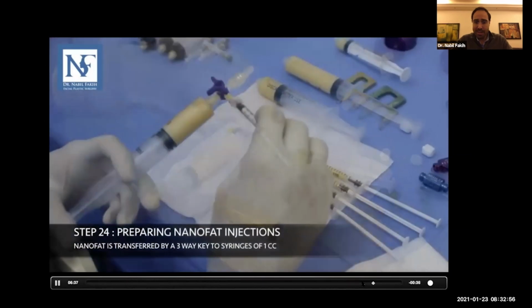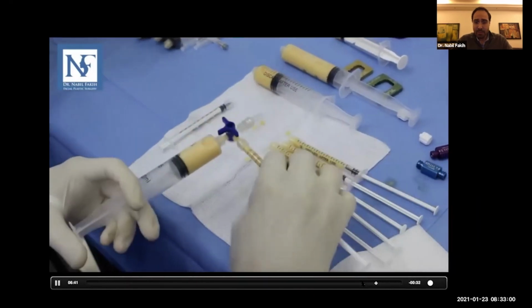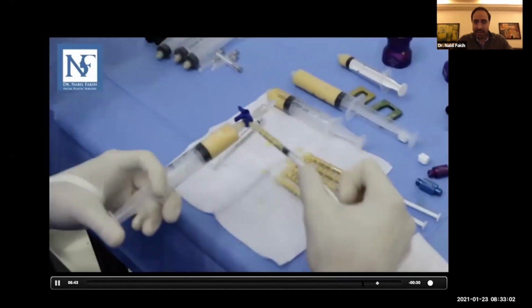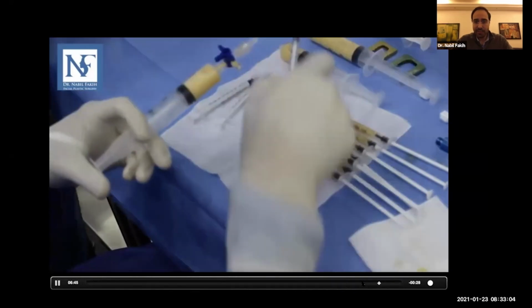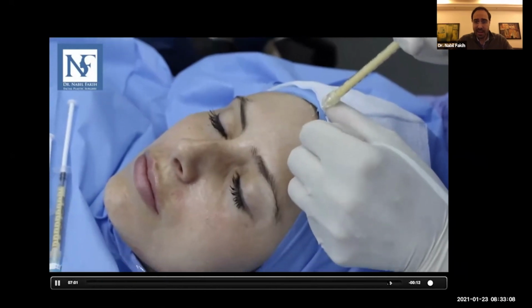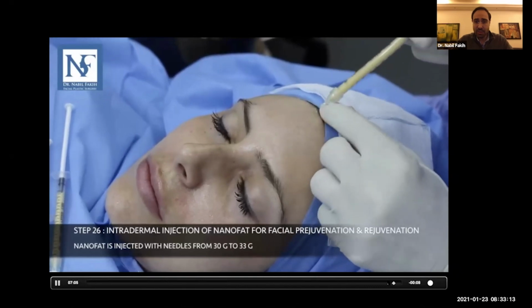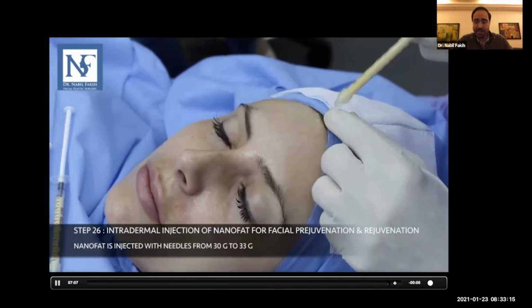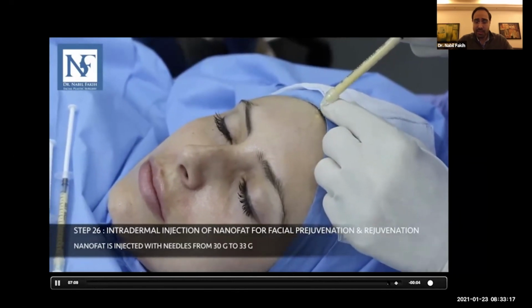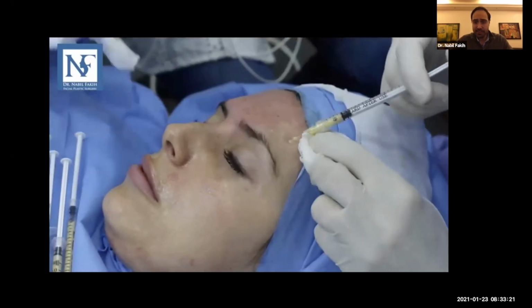We will start preparing 1 cc to inject them in the face. So we prepare all the 1 cc needles to start injecting quickly in the face. Great. So after this, we'll start injecting on the face, area by area. And since it's nanofat, we're doing intradermal injection. You should see bumps everywhere in the face, and we start injecting all the face. So this is how we go fast with it.